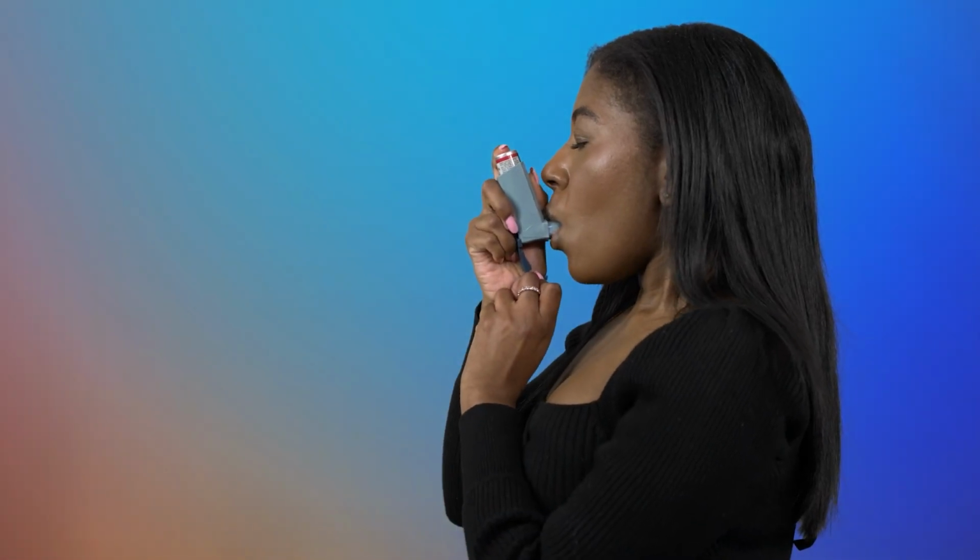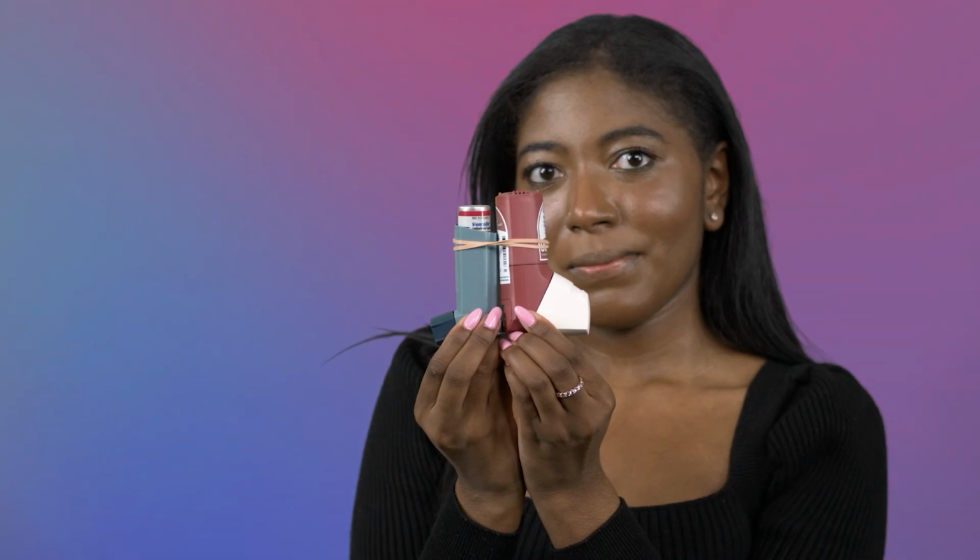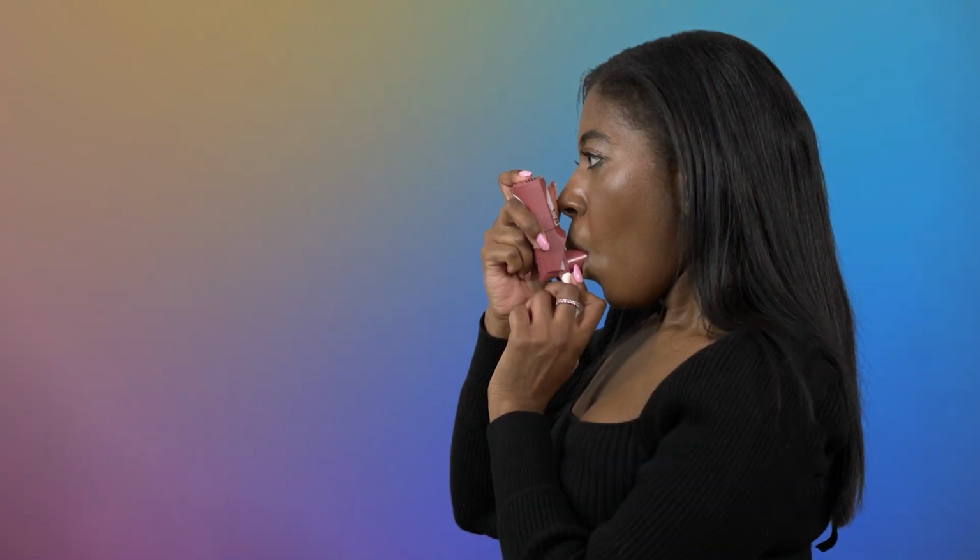For example, if you have symptoms and feel you need to take your rescue inhaler, take the 1 or 2 puffs of your usual rescue inhaler as you feel you need. Then, take the same number of puffs of the PARTICS inhaler, just like we are showing here. If you can't nest your inhalers, you can still tie them together with a rubber band and use one after another. So if you take 1 puff of the rescue inhaler, then take 1 puff of the PARTICS inhaler. If you take 2 puffs of the rescue, then take 2 puffs of the PARTICS inhaler.